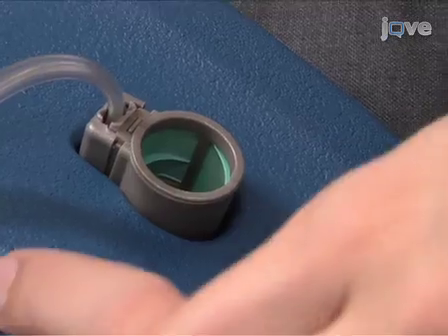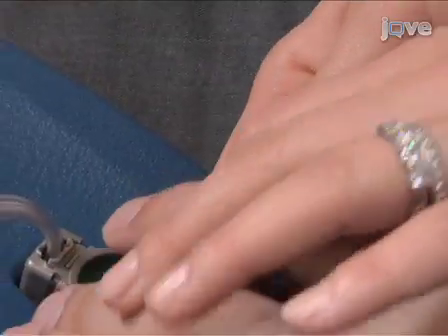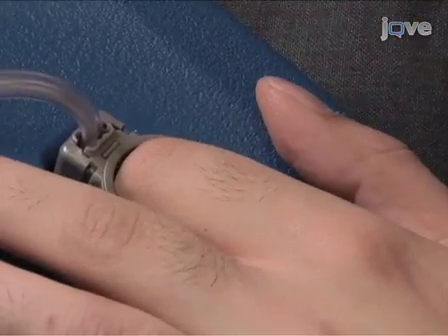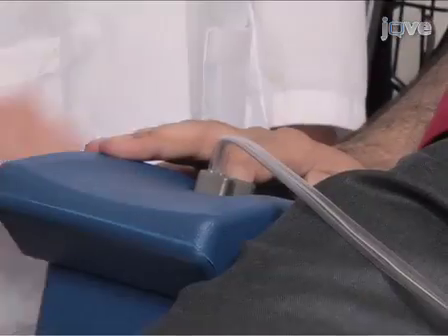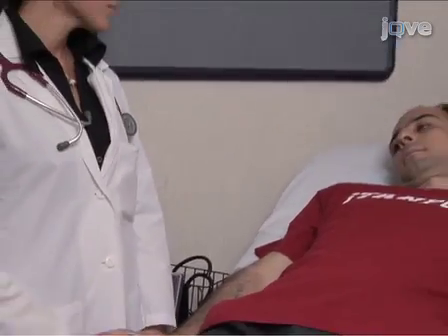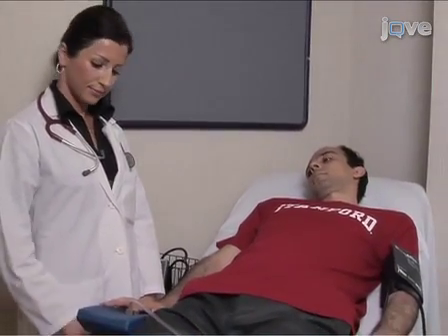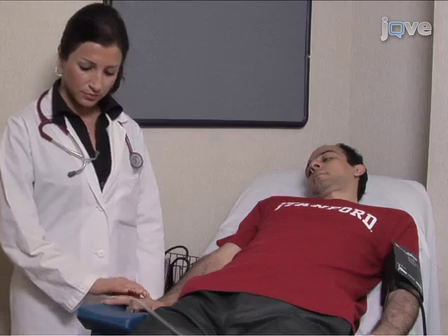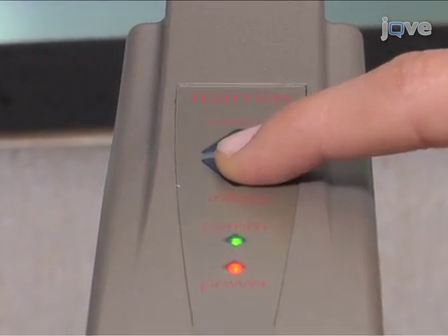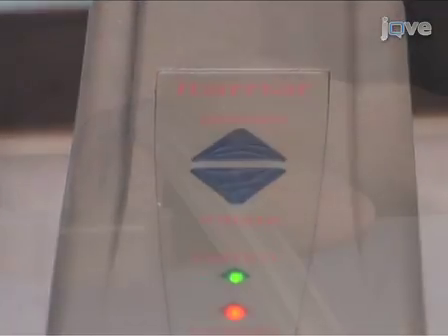Ensuring that it is free from cuts and injury, select a finger, preferably the index finger, for placement of the Endo-PAT probe. Make sure the fingernail is appropriately trimmed. Prior to beginning the experiment, ensure that the study finger is put all the way into the back of the probe. The patient should indicate that they can feel the back of the probe with the tip of their finger. After about 5 seconds, push the inflate button on the top of the Endo-PAT 2000 device.